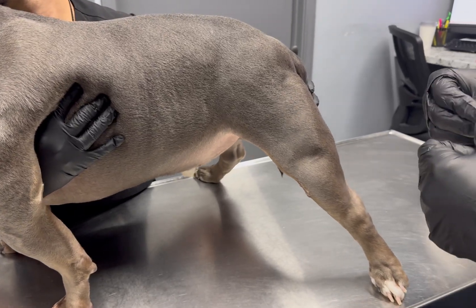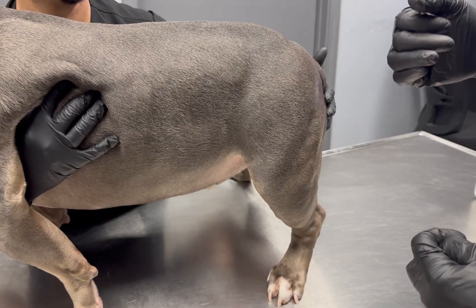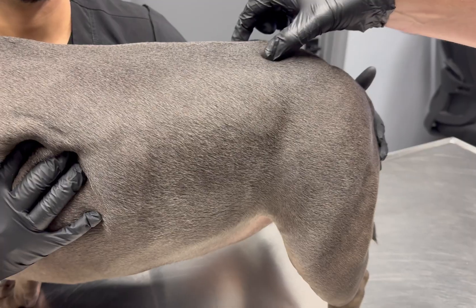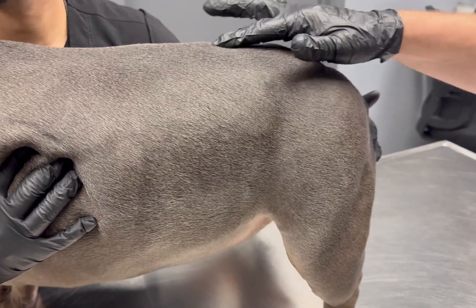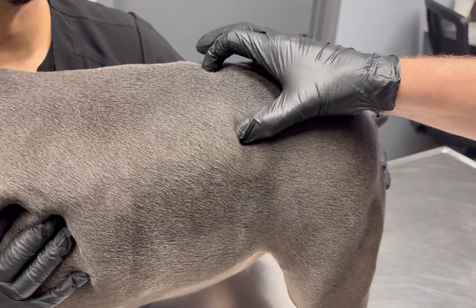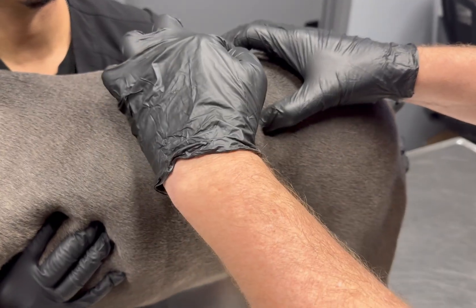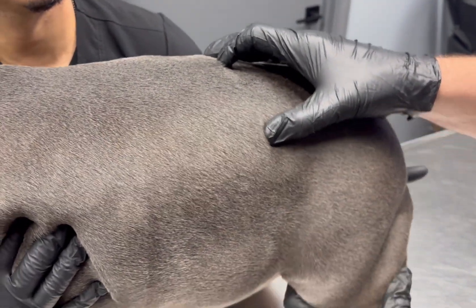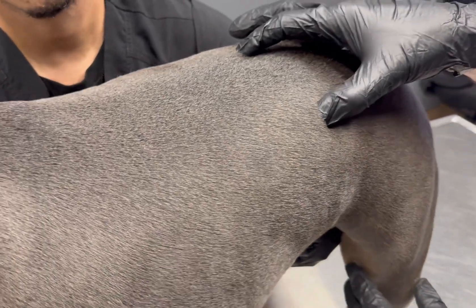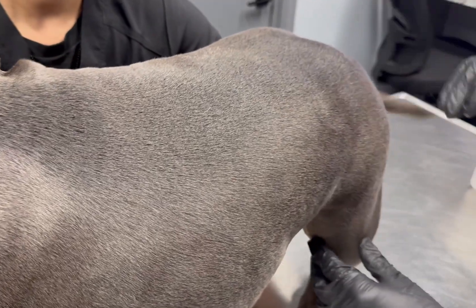What I want to demonstrate here is an IM injection, or intramuscular. Usually we'll do it in one of three places. One is right here along the epaxial muscles that run on either side of the spinous processes. You would find a spinous process, find the edge of that epaxial muscle, and then come in and inject here. This is where heartworm treatments are given typically, because they're very painful — if given in the leg, they would be lame. So we give them in the back muscle so that it doesn't hurt as bad.